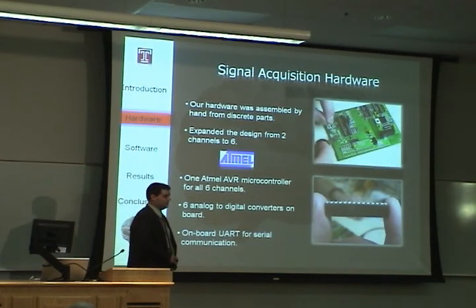We made a couple design modifications to the hardware along the way. We expanded the system from 2 channels to a maximum of 6 channels. And this was supported by the AVR microcontroller that we used, which has 6 onboard analog to digital converters. Also, it features a UART for serial communications, all contained within the microcontroller itself.